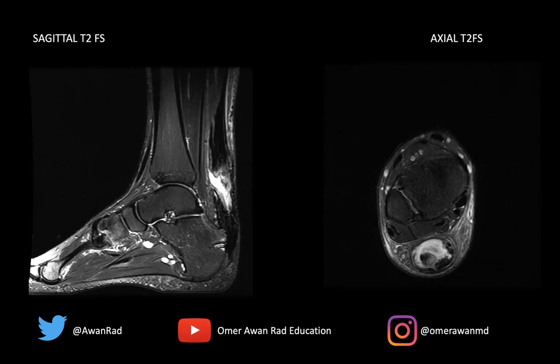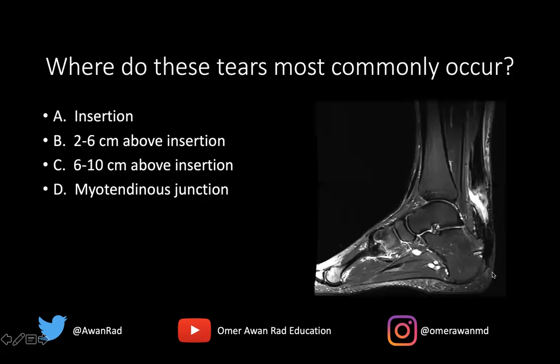Here we have a sagittal T2 FATSAT image of the ankle and an axial T2 FATSAT image of the ankle, and we have an obvious abnormality seen on these images. The question I have for all of you is: where do these tears most commonly occur? Is it at the insertion, 2 to 6 centimeters above the insertion, 6 to 10 centimeters above the insertion, or at the myotendinous junction?